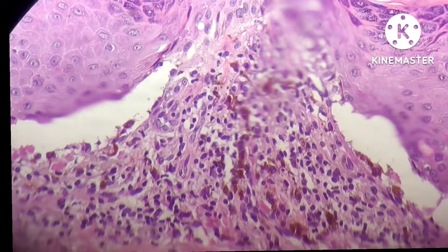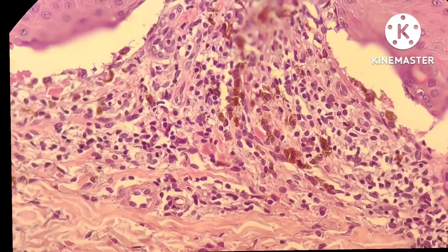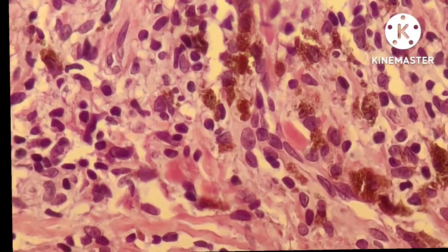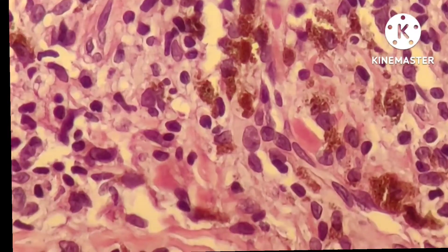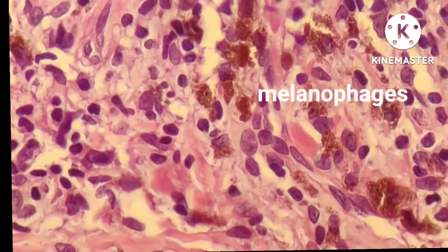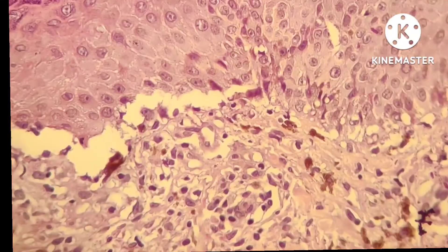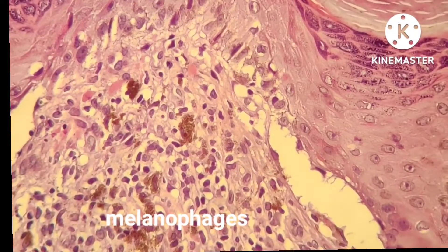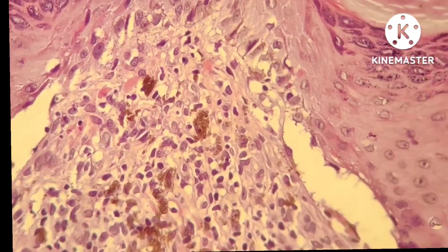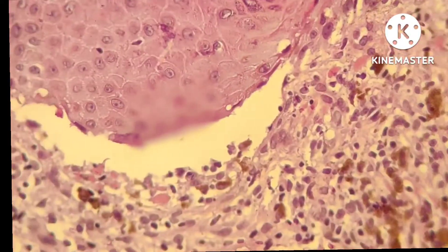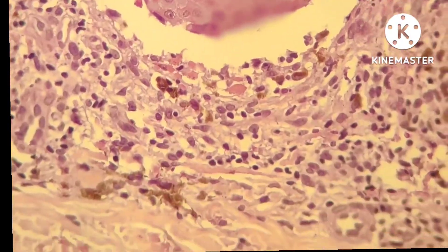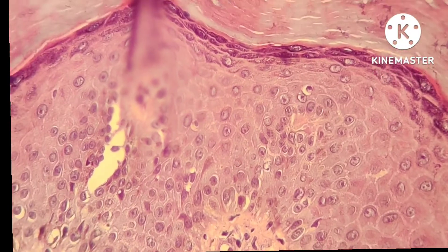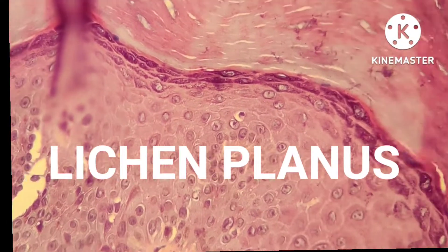Putting all the microscopic findings together: compact hyperkeratosis, no parakeratosis, irregular acanthosis, saw-toothed appearance, hypergranulosis especially wedge-shaped, band of inflammatory infiltrate closely hugging the epidermis, Max-Joseph space, basal vacuolar degeneration, civatte bodies, and inflammatory infiltrate consisting of lymphocytes, macrophages and plenty of melanophages. So the diagnosis is lichen planus — interface dermatitis.